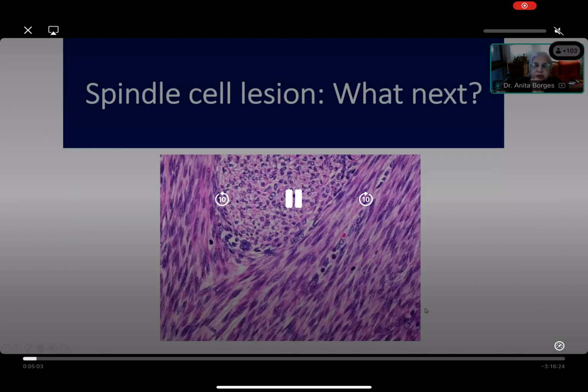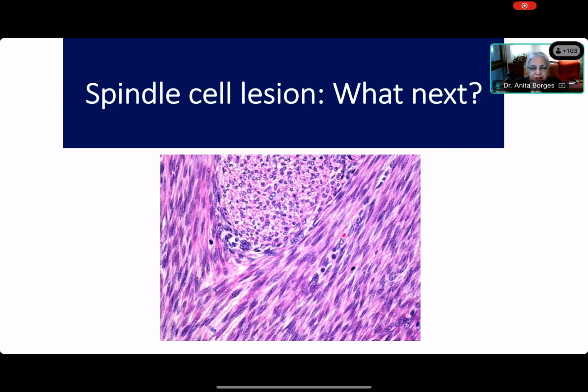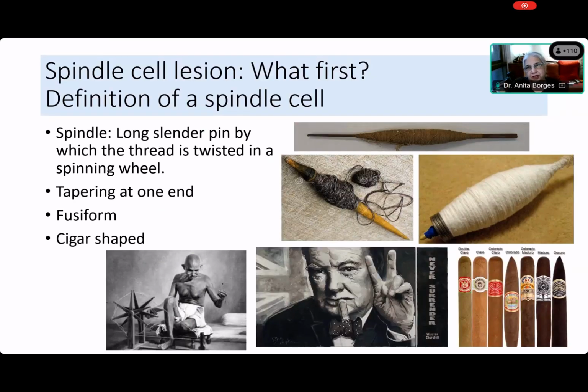Now everybody knows that you can see over here a spindle cell lesion, and the subject of this slide seminar is what next. But before we go to what next, I don't know why we've got this bad echo. I hope it disappears on its own. The first thing that we have to ask is what first, and what first is to define what is a spindle cell.